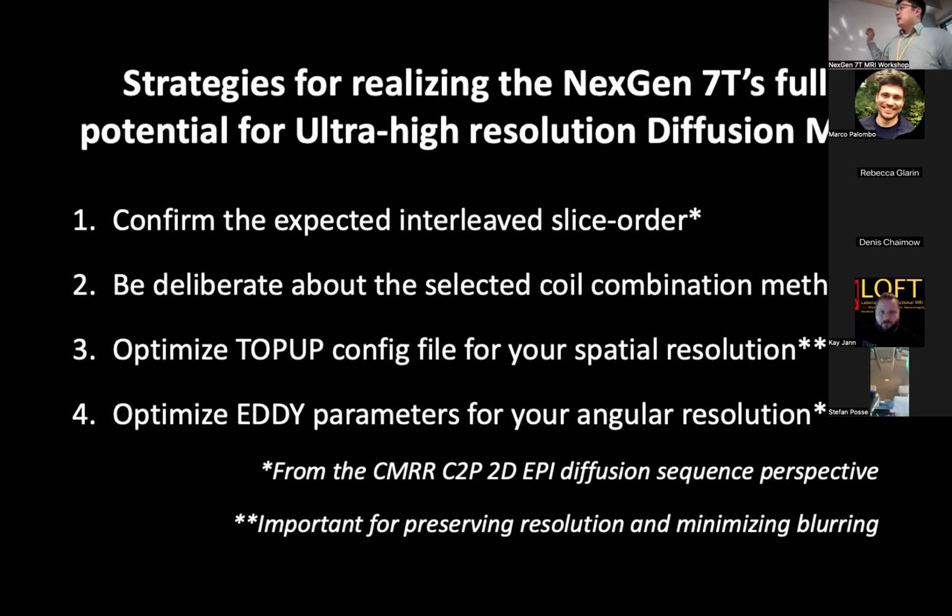And for the last two, I just wanted to highlight again that if your data is blurred and not corrected, if your data is distorted and not corrected properly across all of your time series, when you aggregate all of it in your final analysis, it's going to be just a mush. And we want to preserve the resolution, as everyone's talking about. We care about mesoscale. So just to give you that context before we get into it.